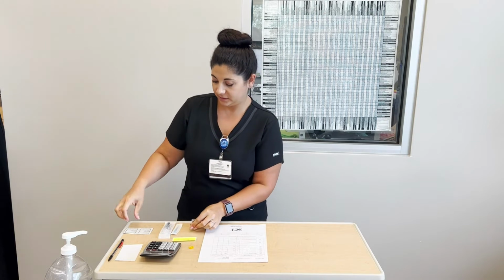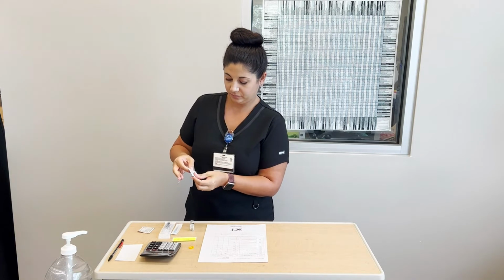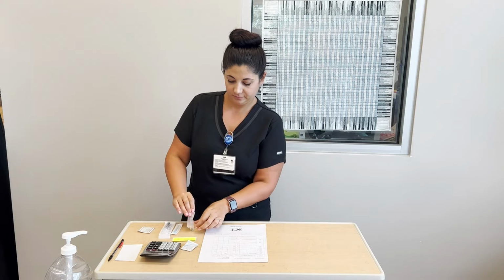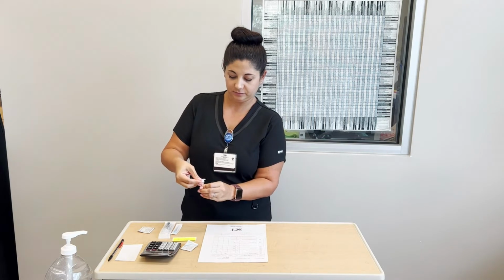Take off the dust cap. Clean vigorously for 15 seconds.